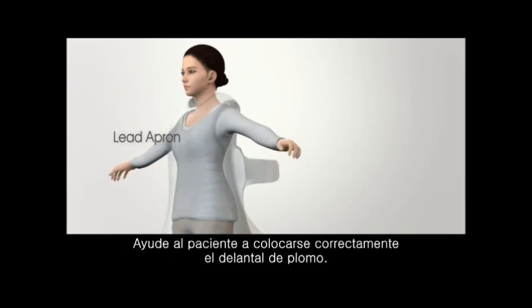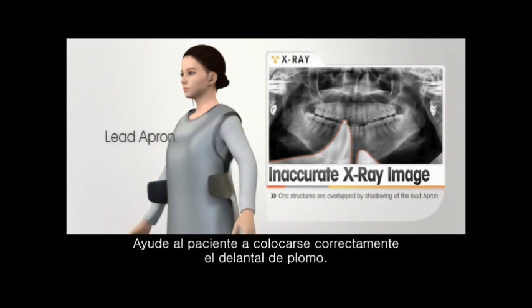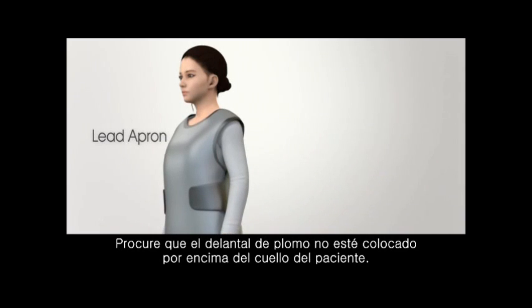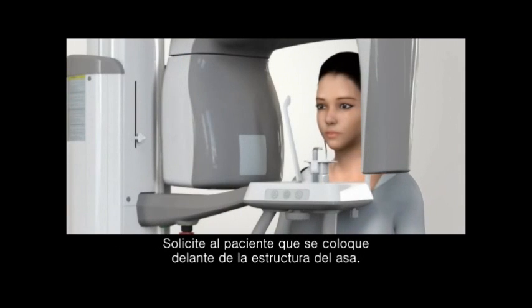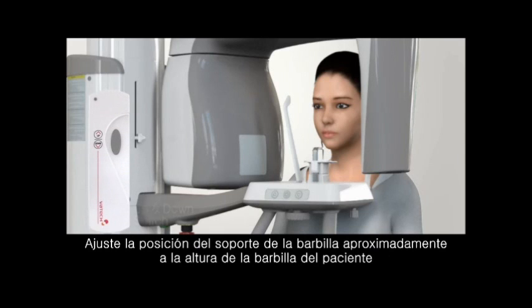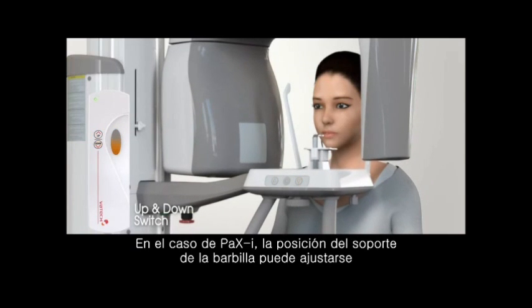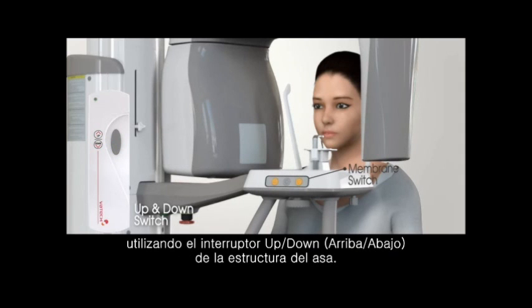Assist the patient to appropriately wear the lead apron. Be careful the lead apron is not above the patient's neck. Ask the patient to stand in front of the handle frame. Adjust the chin rest position approximately to the height of the patient's chin using the up-down switch. For PAX I, the chin rest position can be adjusted using the up-down switch on the handle frame.